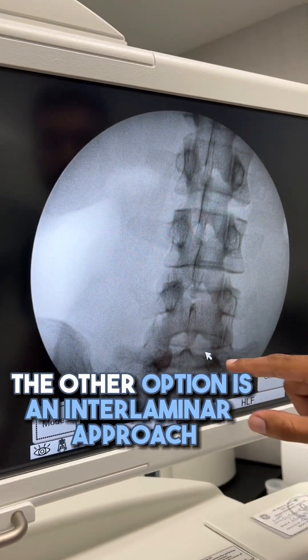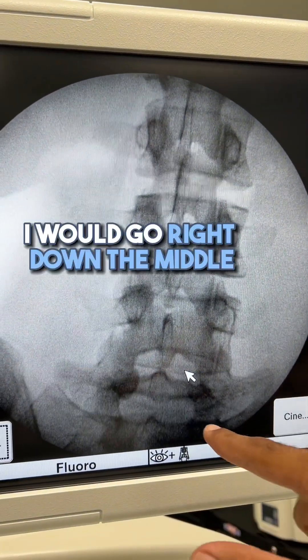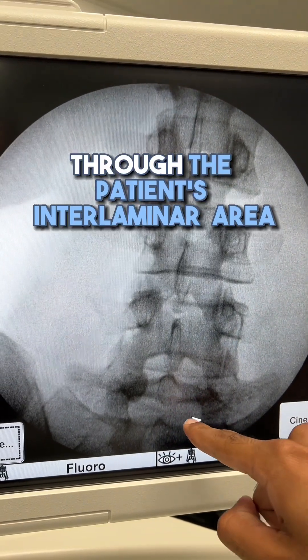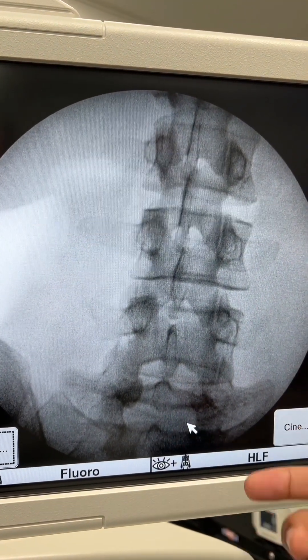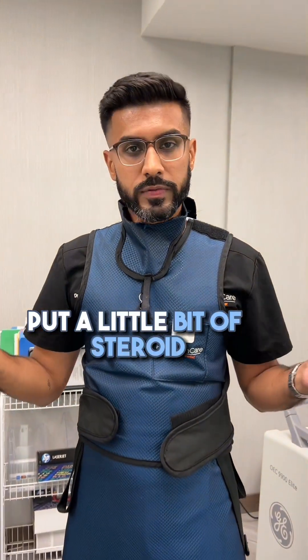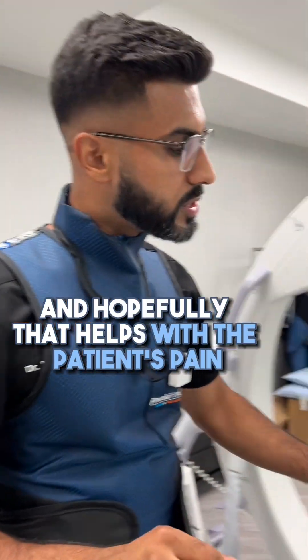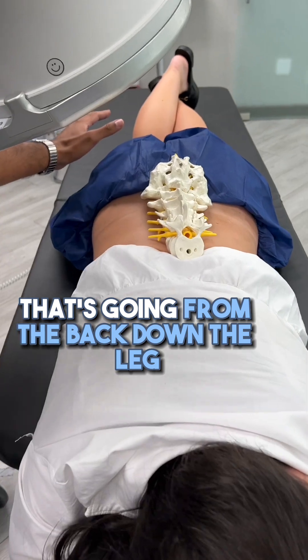The other option is an interlaminar approach. I would go right down the middle, through the patient's interlaminar area, and once again inject contrast, put a little bit of steroid, and hopefully that helps with the patient's pain that's going from the back down the leg.